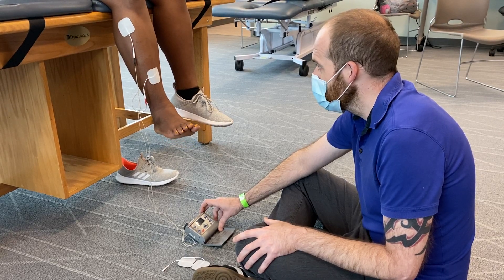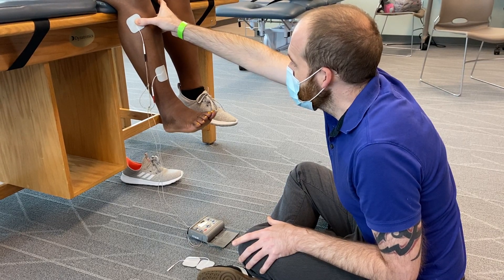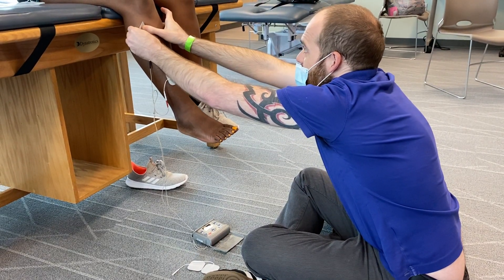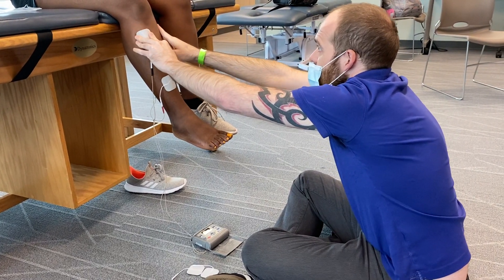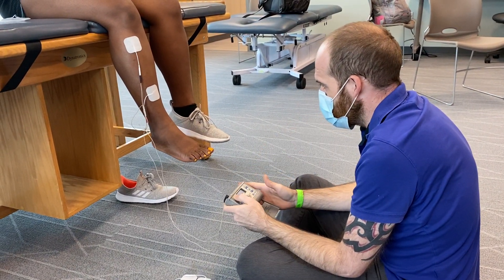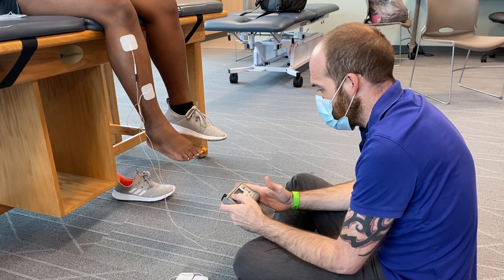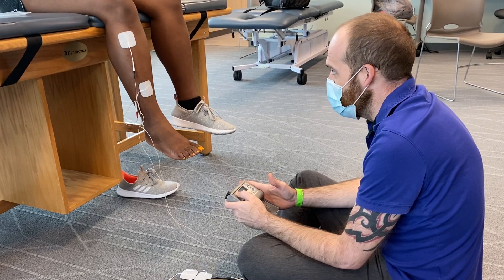See, that's a little too much eversion. But see what happened when I moved the pad over — I got pure dorsiflexion. So I'm going to pause it and move this pad to the front. This is common with the ankle: to get dorsiflexion you have to play around with the electrode placement because everybody's just a little bit different.